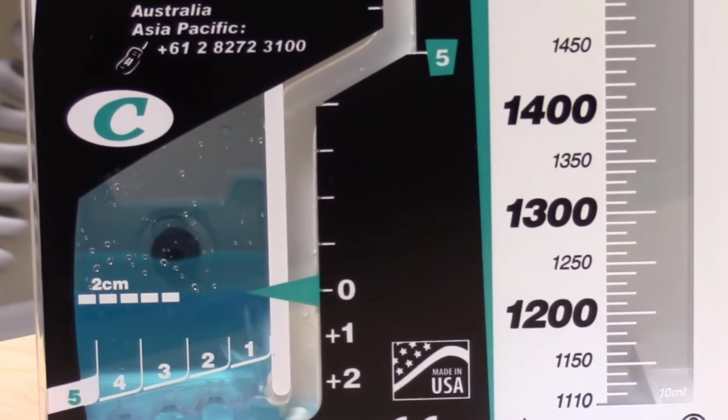Next, assess for an air leak by looking for bubbling in the water seal chamber. Bubbling indicates there is an air leak somewhere in the system. It could be at the patient insertion site, in the tubing or tubing connections, or a crack in the chest drain itself. The graduated markings help to quantify the size of the air leak from 1 at the lowest to 5 at the highest. Bubbling may be continuous or intermittent.